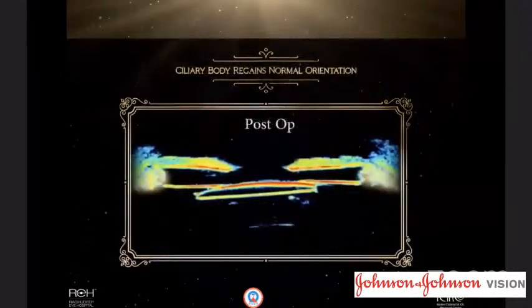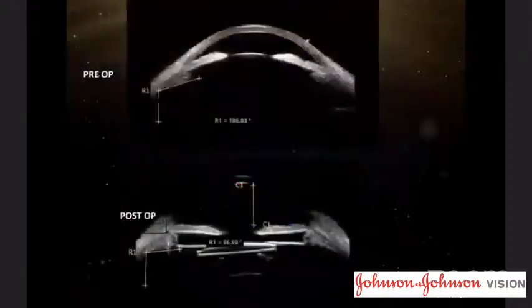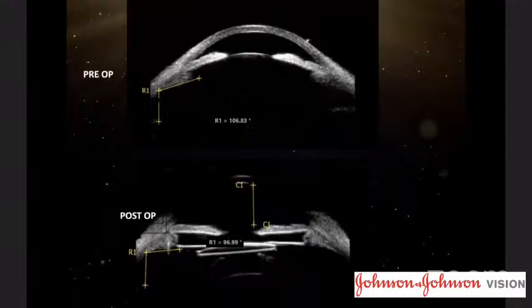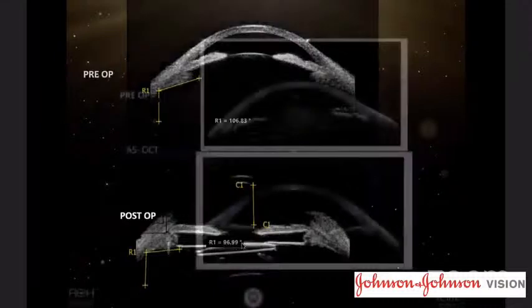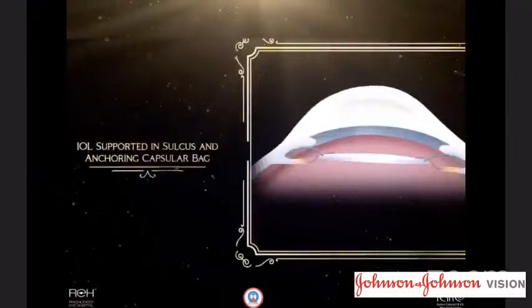So in other words, the possibility of malignant glaucoma or a persistence of the narrowness of the anterior segment following cataract surgery is easily avoided, time after time, in this situation. You can see the rotation of the ciliary body anteriorly, now going back here, a lot of space here, and you can demonstrate in all the imaging technology convincingly the space created.